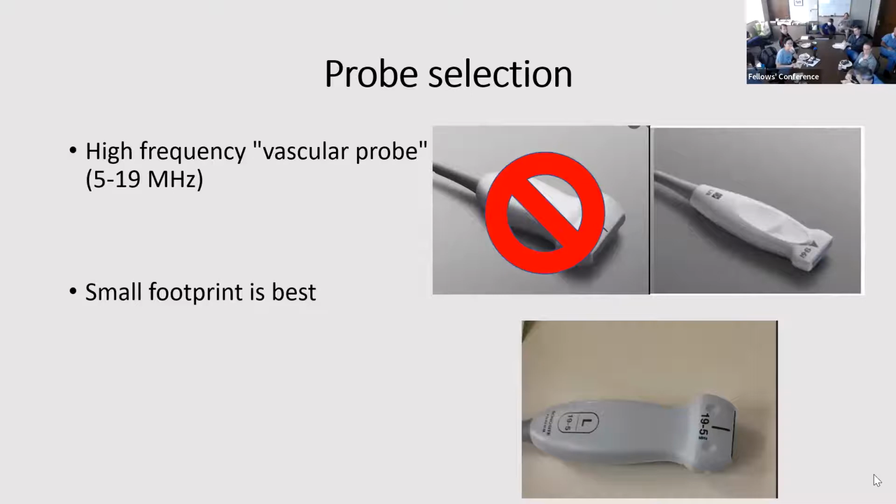You can use a smaller vascular probe that we have at Espinosa as well, but it's on just the ultrasounds that the nurses use. So if you're doing a DVT scan, particularly if you're trying to get that popliteal vein, I recommend you use a smaller vascular probe. At university, you have this microvascular probe, which is excellent. I wish we had this probe on all of our ultrasounds, but you either want to choose this probe or this probe.